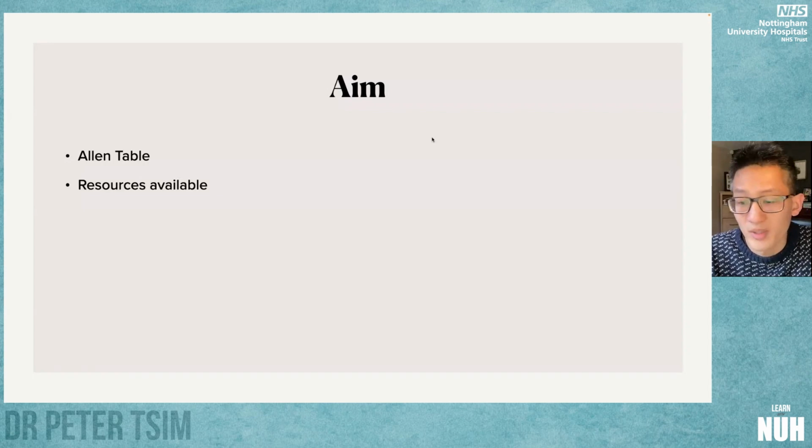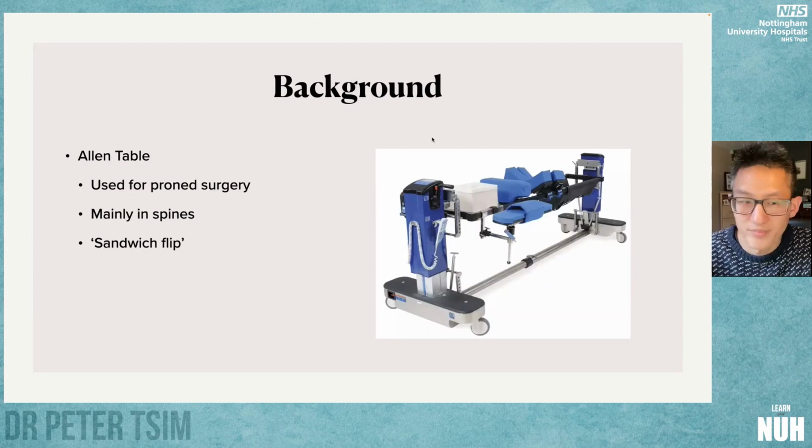Helen Fenner, Kevin Tate and I have been working over the last 18 months on some resources to try and help with this. What I'm going to do today is remind you about how to use the Allen table, and also draw your attention to the resources that are now available and some which are up and coming. So a bit of background to begin with.